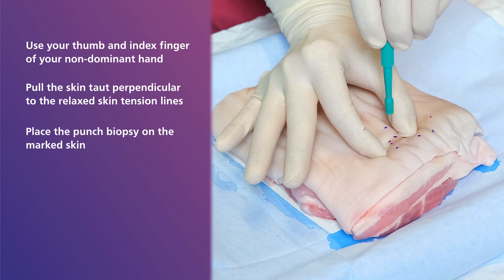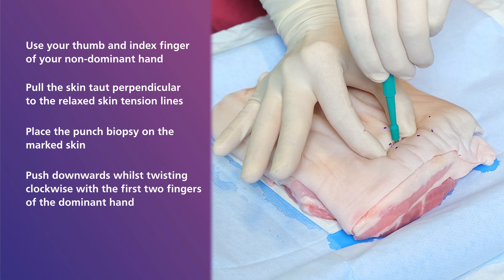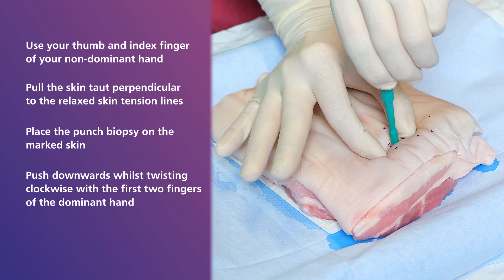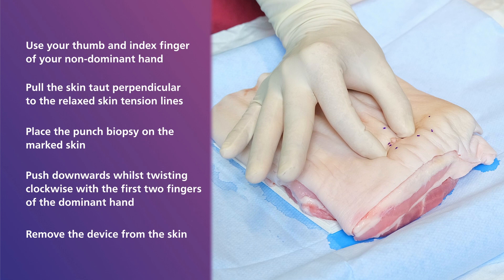Then proceed by placing the punch biopsy on the marked skin, pushing downwards whilst twisting clockwise with the first two fingers of the dominant hand. Then remove the device from the skin.